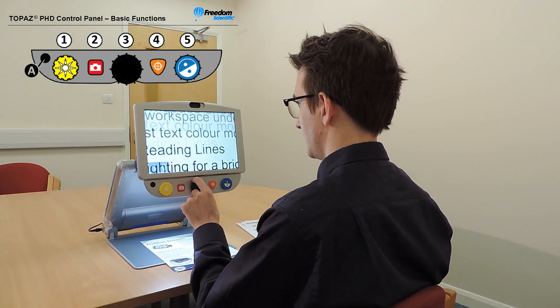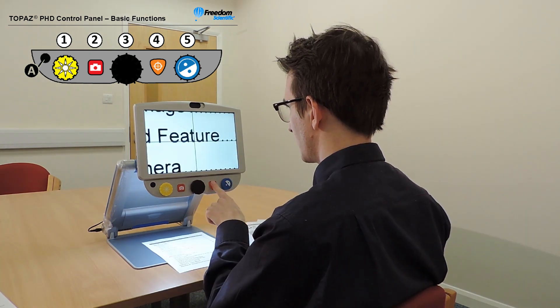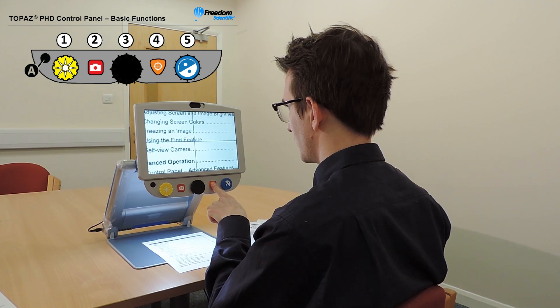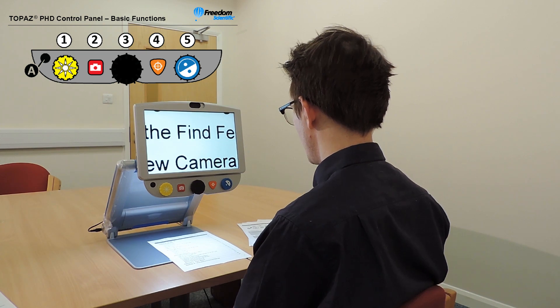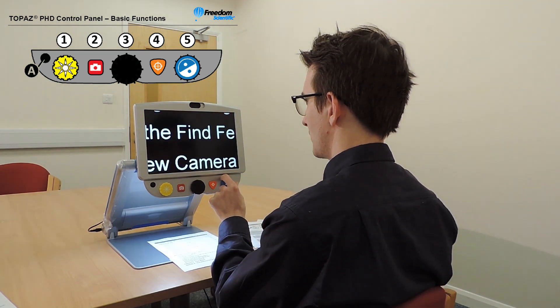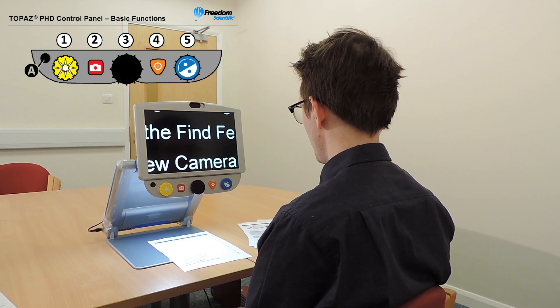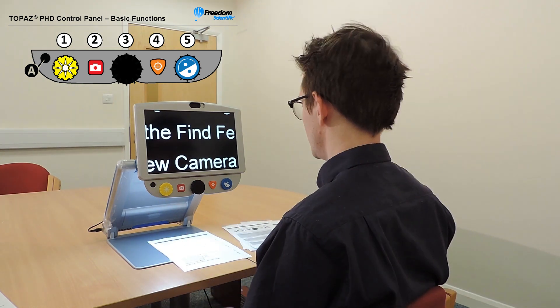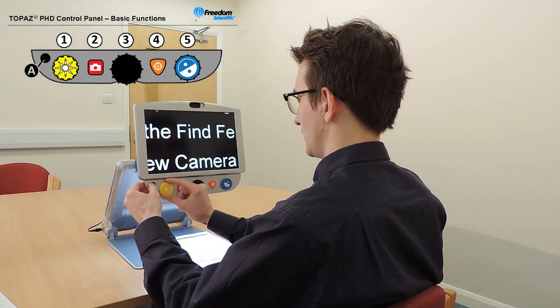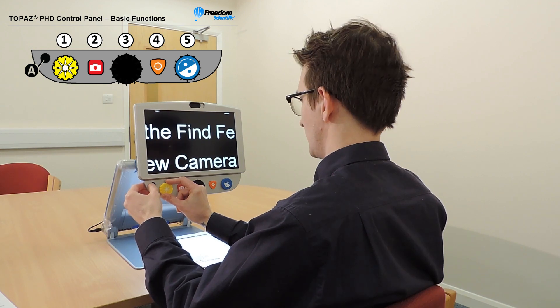Use the black magnification dial in the centre to zoom in and out with ease. Press and hold the orange find button to zoom out and display crosshairs on the screen to help you reposition the object under the camera; release it to return to the previous magnification level. Use the blue colour mode dial to cycle through the available colour modes. The small black advanced button on the left hand side is used in combination with other controls to access advanced features — always press and hold the advanced button first, then press or turn the other buttons or dials to perform the advanced task.